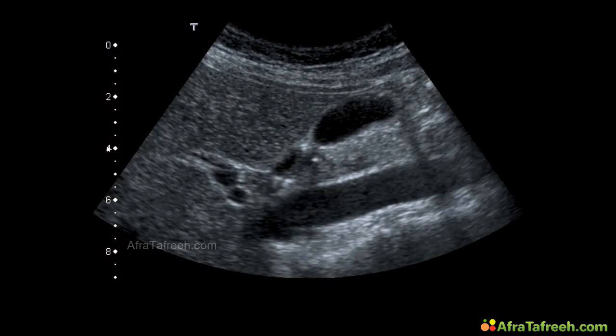Okay, the structures over here, do you want to explain? Fine, it's a lovely picture. The gallbladder over here, liver parenchyma, and here we see the IVC. Inferior vena cava, yes. Okay, proceed to the next one.